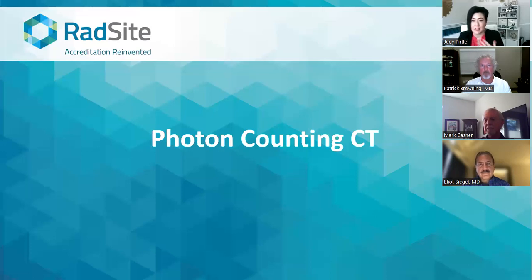So from an outpatient imaging aspect, yes, we would love to have the newest and best for everything. Unfortunately, the lifespan of a CT machine is pretty long, and for what you pay for it, versus the need. I think that's what you have to really take into account: what is your need in the area that you work in, say a center in Dallas as opposed to a center in Wichita, Kansas? What does the patient need?